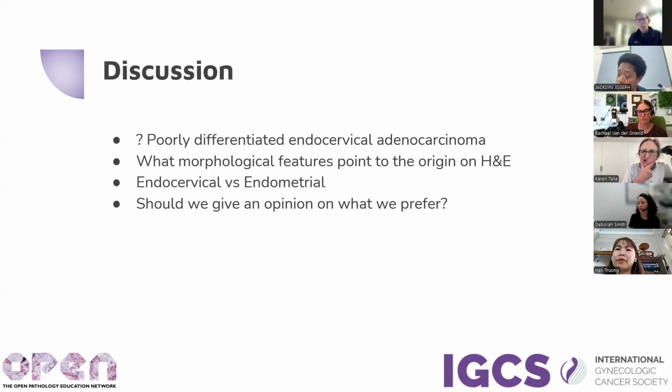Yeah. I think the problem, Karen, is that if it did, how would you separate them on what you have, apart from a mucin stain? But it's going to be so low reliability. You'd have to make a call on morphology, I think. Yeah. So you're still back at that point. Certainly, we've had slides come in from the Pacific with HPV-driven tumours, and they are incredibly ugly. And with a panel of IHCs, we can't get to the bottom of it. Yeah. So I have a respect for how ugly the carcinomas can look as well. But that does make it very, very hard.